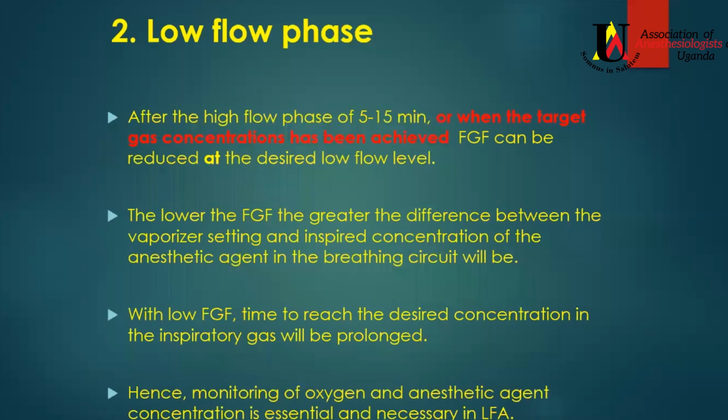Then we move to the low flow phase. This is now where you are going to be in your cruising phase. So after the initial high flow phase of 5 to 15 minutes, or when the target gas concentration has been achieved, then you can start to reduce the fresh gas flow to the desired low level.